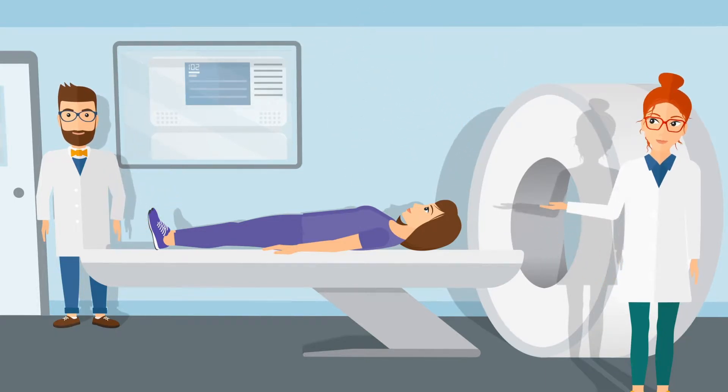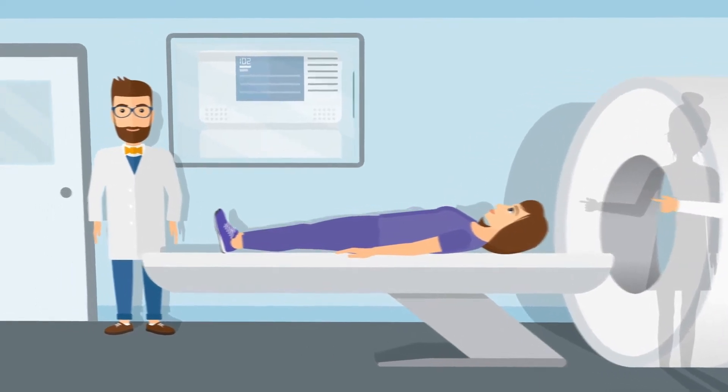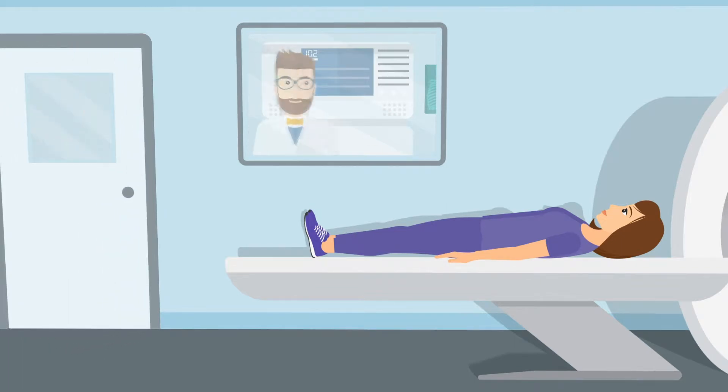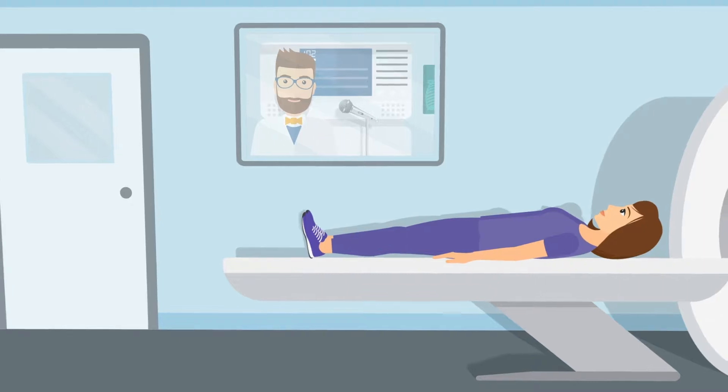Once you're comfortable, the technologist leaves the scanning room to control the examination from a console next door. The technologist will be able to see, hear, and speak to you at all times via intercom and through the viewing window.